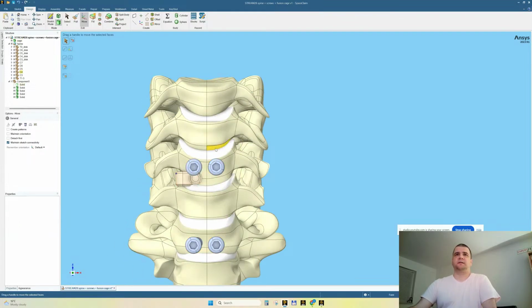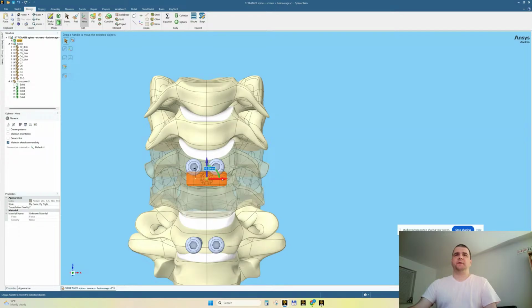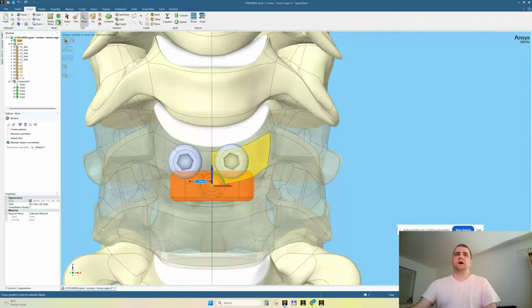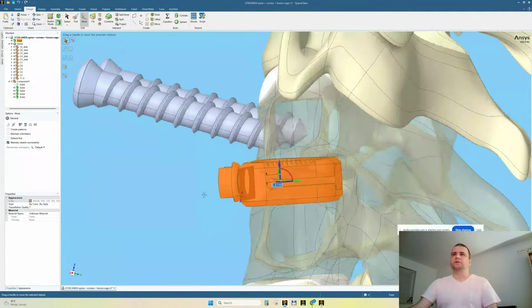Let's hide this plate at this moment. And these parts, let's make them transparent. Click a face, transparent, click a face, transparent. Of course, I don't need the disk. Triple click, delete, triple click, move. I'm talking on a microscopical level, exactly on the axis, but we do need to reorient it to replace the former disk, which was excised or surgically removed.